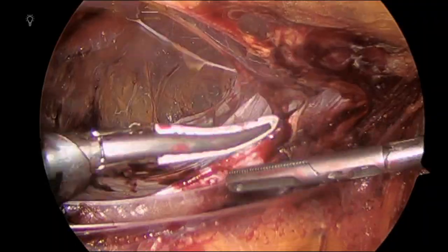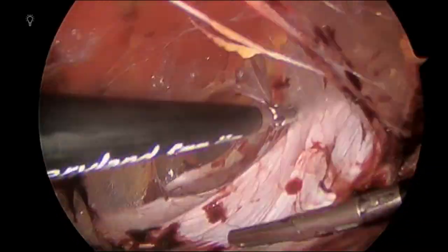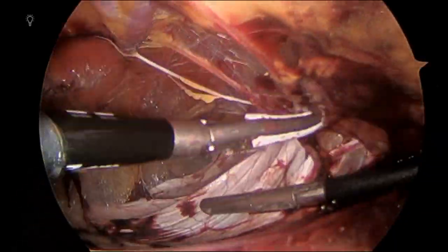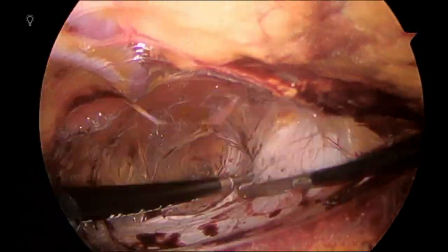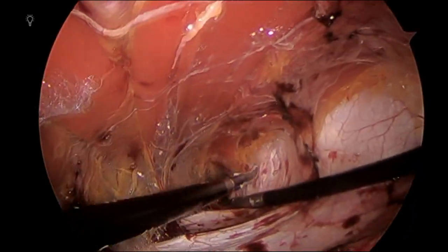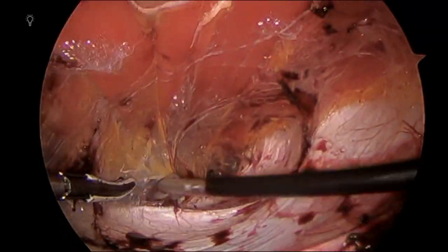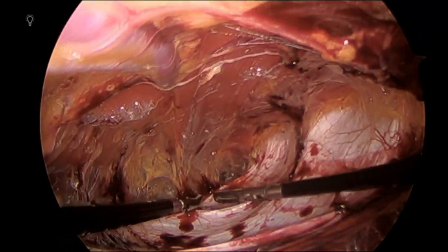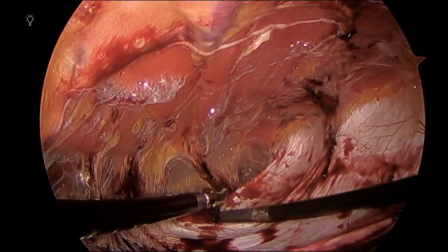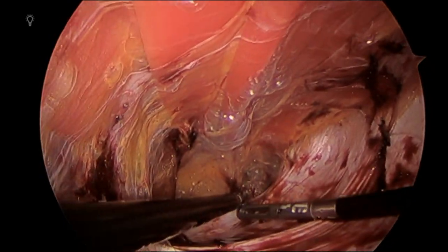Now I will dissect the right retrorectus space all the way up to the subcostal area. I try to use energy only in the midline and only atraumatic dissection in the lateral side to diminish the risk of injuring the semilunar line.